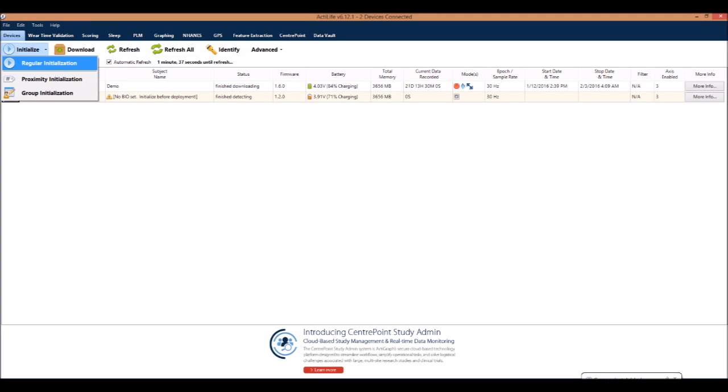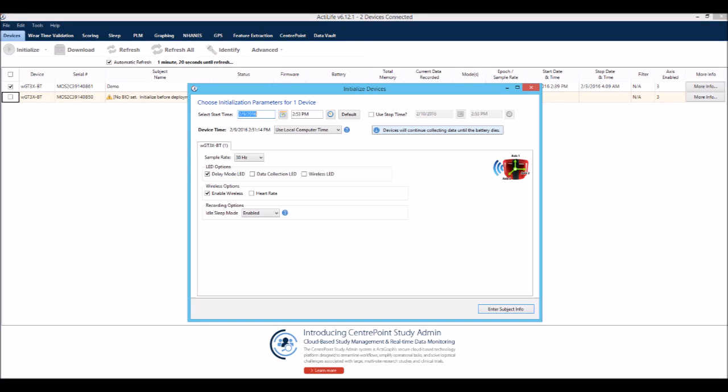Next, click the Initialize button and select the appropriate type of initialization. This will prompt a new window to open where you will select the desired data collection parameters, otherwise default parameters will be used. Here you will enter the dates and times when the device should start and stop collecting data.